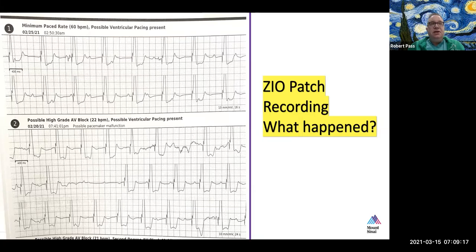So let's say you're in the office and you record some intracardiac electrograms, which you can do in a permanent pacemaker, and you see the artifact happen right in front of your eyes. And the electrogram is, say, 5.6 millivolts. So you could make the sensitivity, say, 8 millivolts, so that it ignores signals that are smaller than 8 millivolts. Actually, we did that when we saw this phenomenon. And we repeated the Holter and continued to see this.